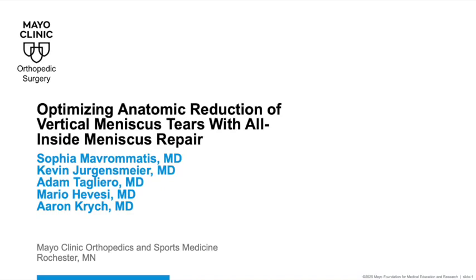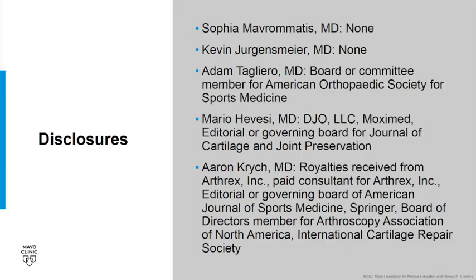Optimizing anatomic reduction of vertical meniscus tears with all-inside meniscus repair. In this technique, we propose the novel use of the arthroscopic skid to aid in the all-inside repair of a meniscus tear. These are our disclosures.